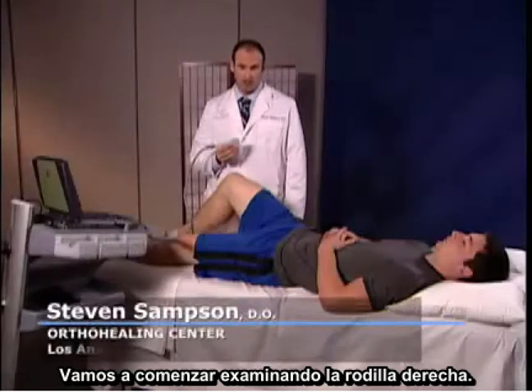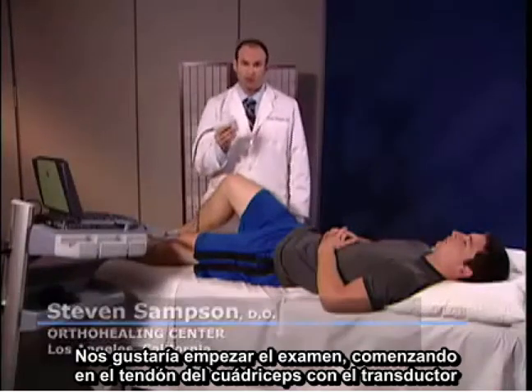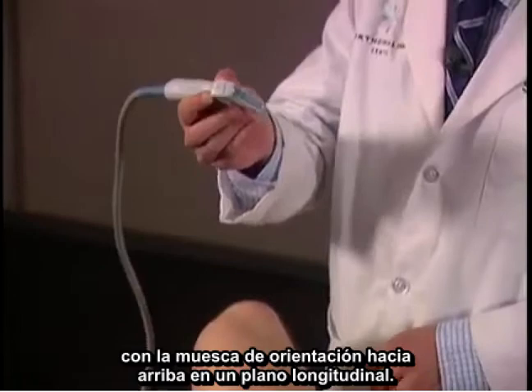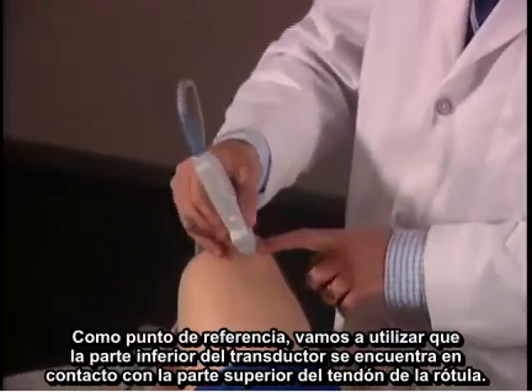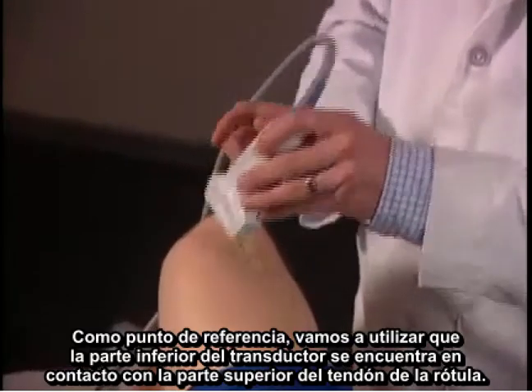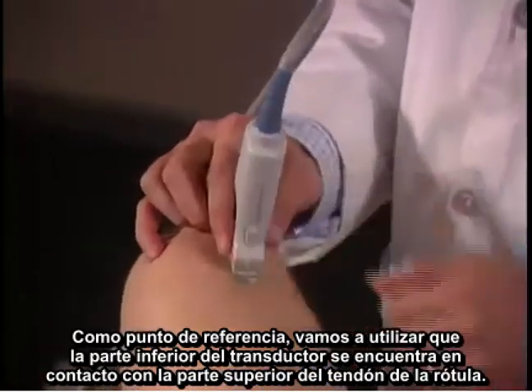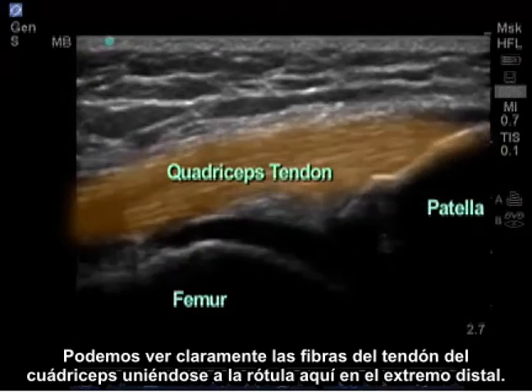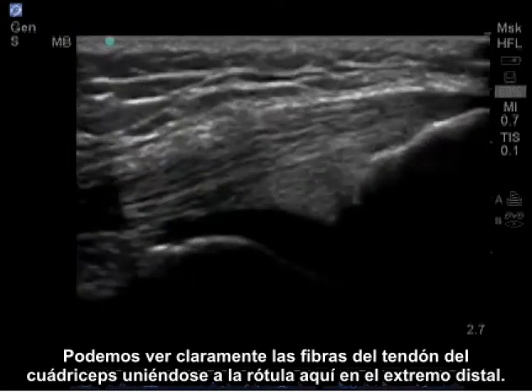We're going to begin scanning the right knee. I like to begin the scan by starting at the quadricep tendon with the transducer, with the notch facing towards the patient upwards in a longitudinal plane. As my landmark, the bottom of the transducer is touching the top of the patella. I can clearly see the fibers of the quadricep tendon attaching on the patella here at the distal end.